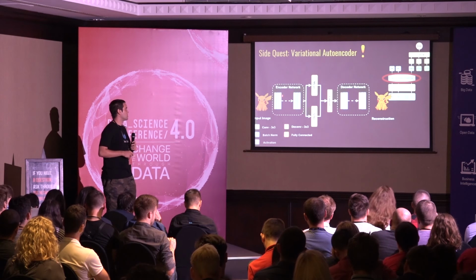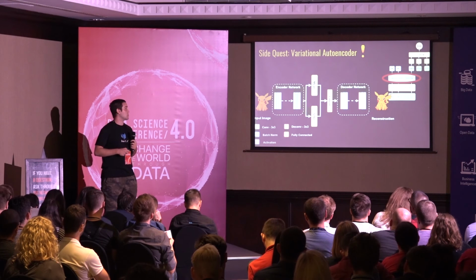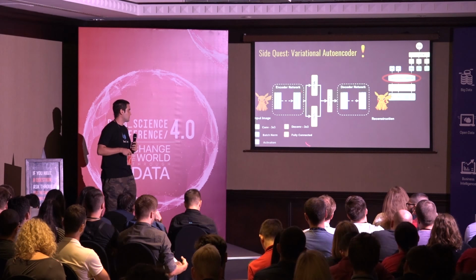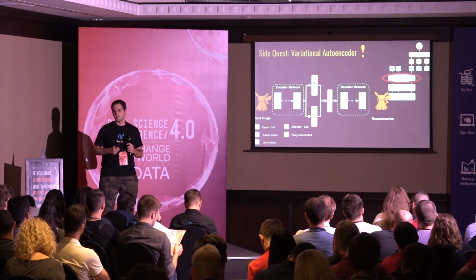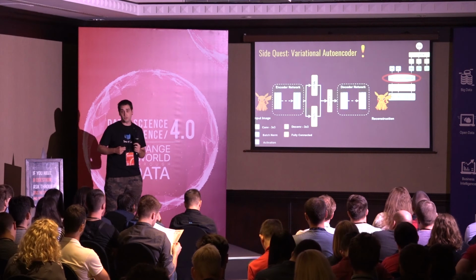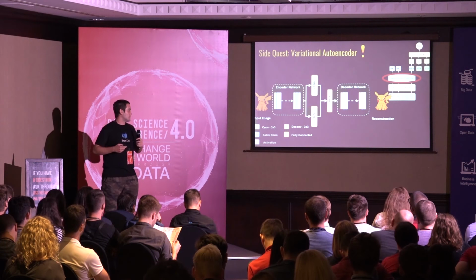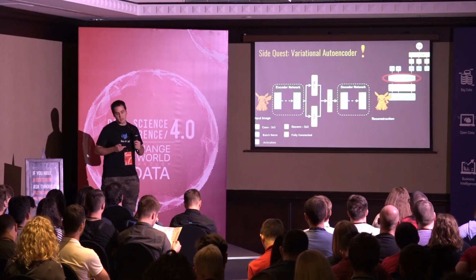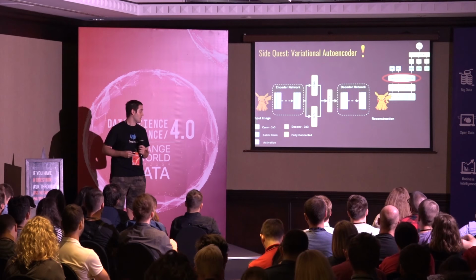Also, in the encoder network, we can use convolutional layers, batch normalization, and skip connections. It doesn't matter, but we must have this part. And I can say that variational autoencoders are a pain to train. I trained them so many times, and each time I have a headache about it. It's so parameter dependent how you set these things up, and when you train it for a long time, you see this bad result for real.